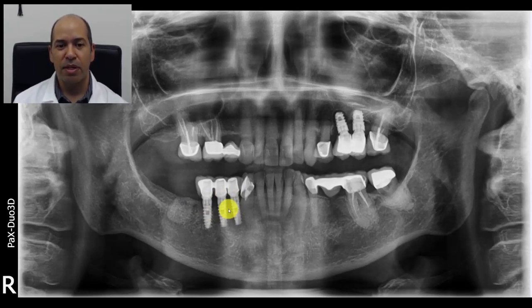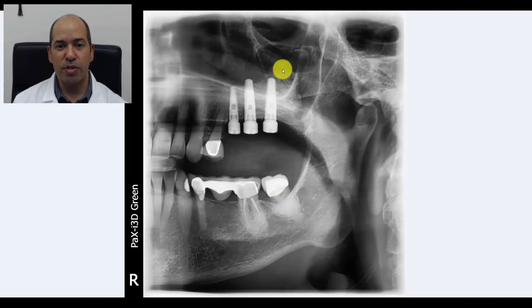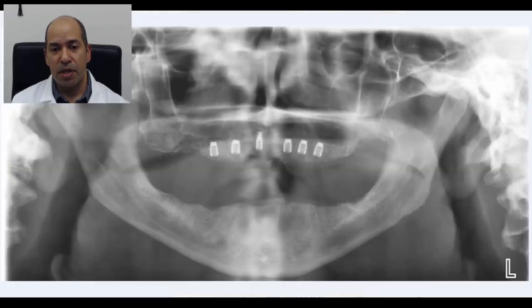That's a decent size implant, probably 13 millimeters long, probably 4 millimeters in diameter. They're connected, though not the best bridge. This patient came to me with these implants loose after three or four years — not just the crowns, but the whole implants. I had to take them out. Since this was a redo, I really wanted to make sure she had a lot of support. I did a lateral window sinus graft and then gave her three implants that are long. I subsequently restored this with a splinted bridge where the teeth are connected. In the lower jaw, you can have fewer and shorter implants, but in the upper jaw, typically more is necessary.